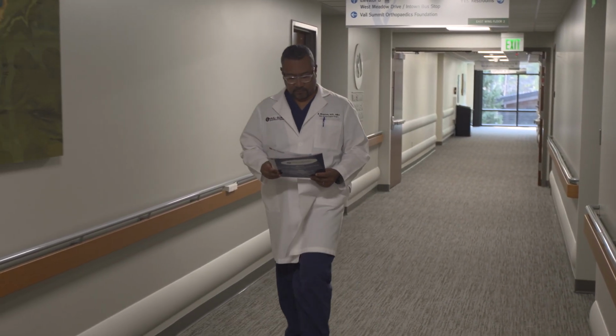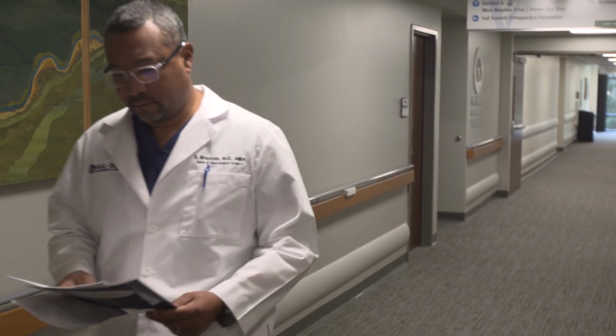It's augmented what we already are capable of doing, but at the end of the day, we really need to know in real time where we're at anatomically. Navigation provides us a picture of the spine, in my case, 20 minutes or an hour ago. And so when I need to refresh that, getting a new spin or refreshing that image can be done in less than 3 minutes.